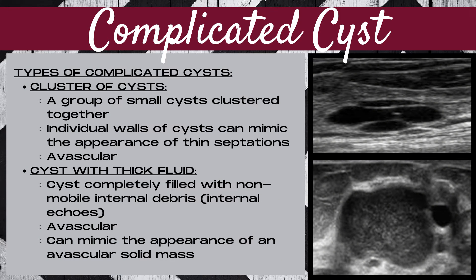The third type of complicated cyst is a cluster of cysts — a group of small cysts clustered together, like a cluster of grapes. The individual walls of the cysts can mimic the appearance of thin septations. A cluster of cysts should be avascular. The fourth type is a cyst with thick fluid, where the cyst is completely filled with non-mobile internal debris. There will be low-level internal echoes throughout the mass, and it should be avascular.